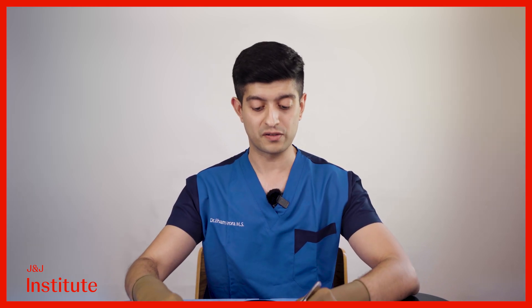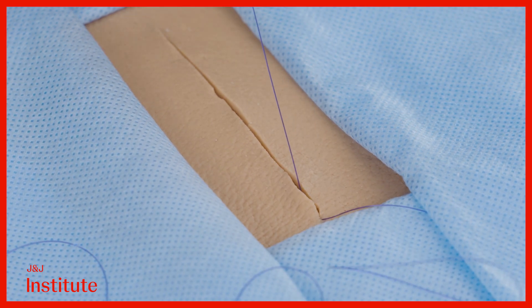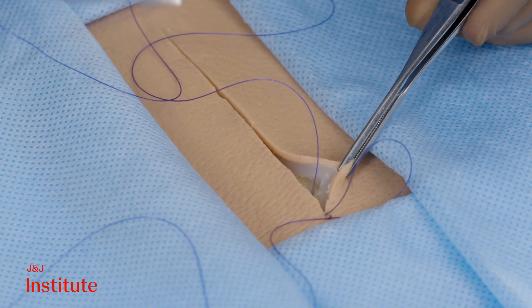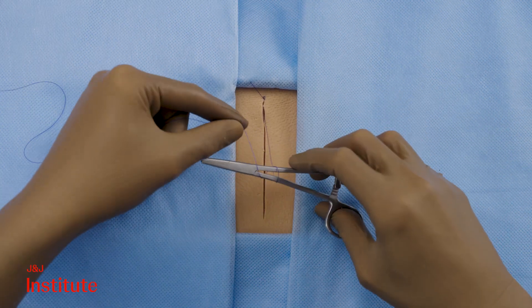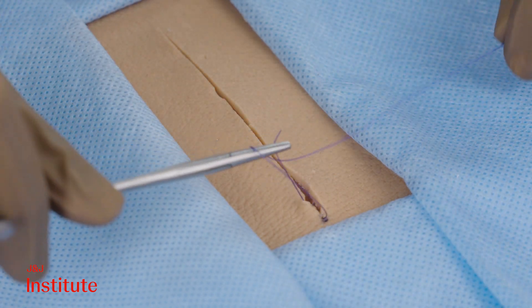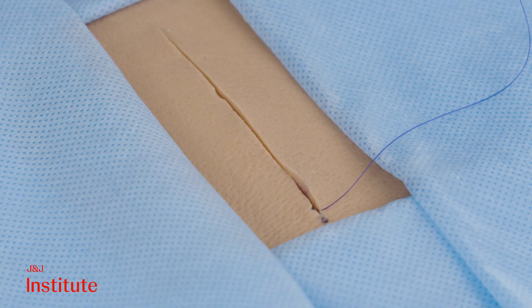The closure begins at the far end of the incision with small bites parallel to the skin surface. The bite on the opposite side is usually taken in a reverse fashion. The suture is tied as usual with a surgeon's knot with another half hitch on top for additional safety. The short end is then cut flush, and as you can see, the knot gets buried down into the incision.